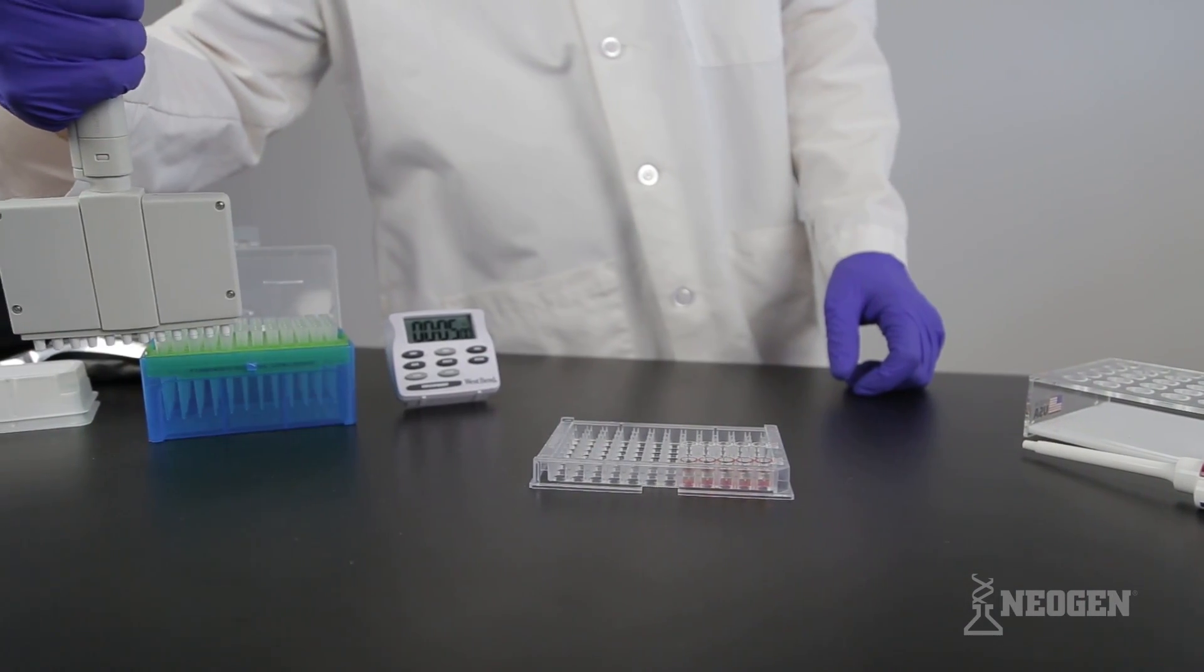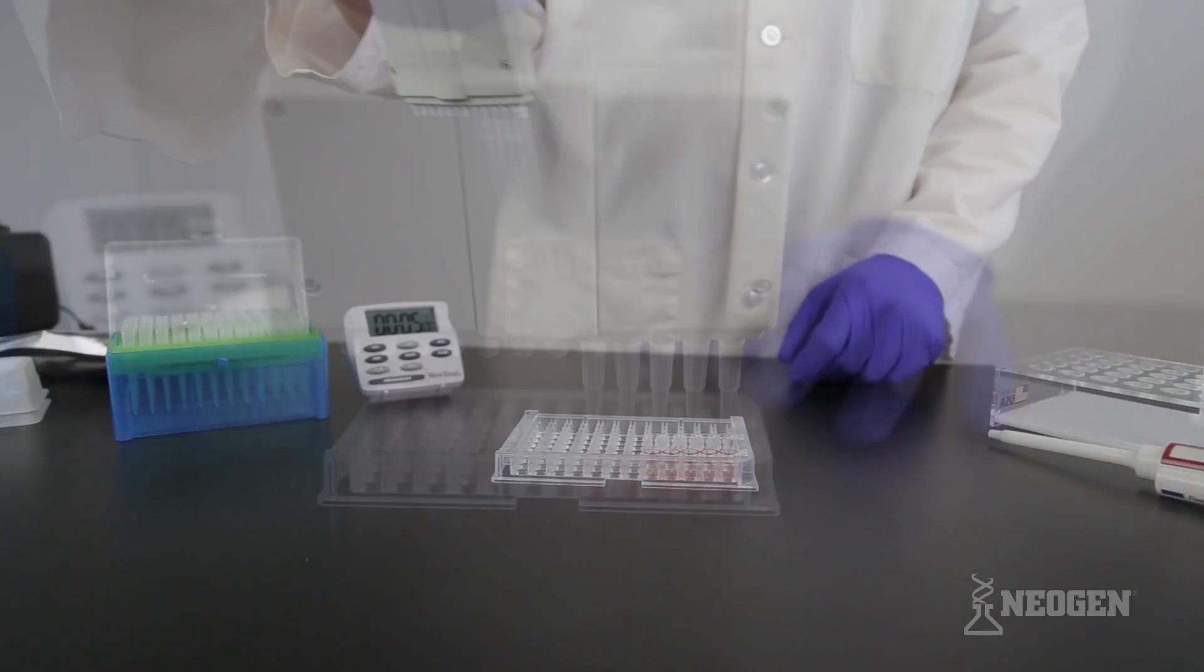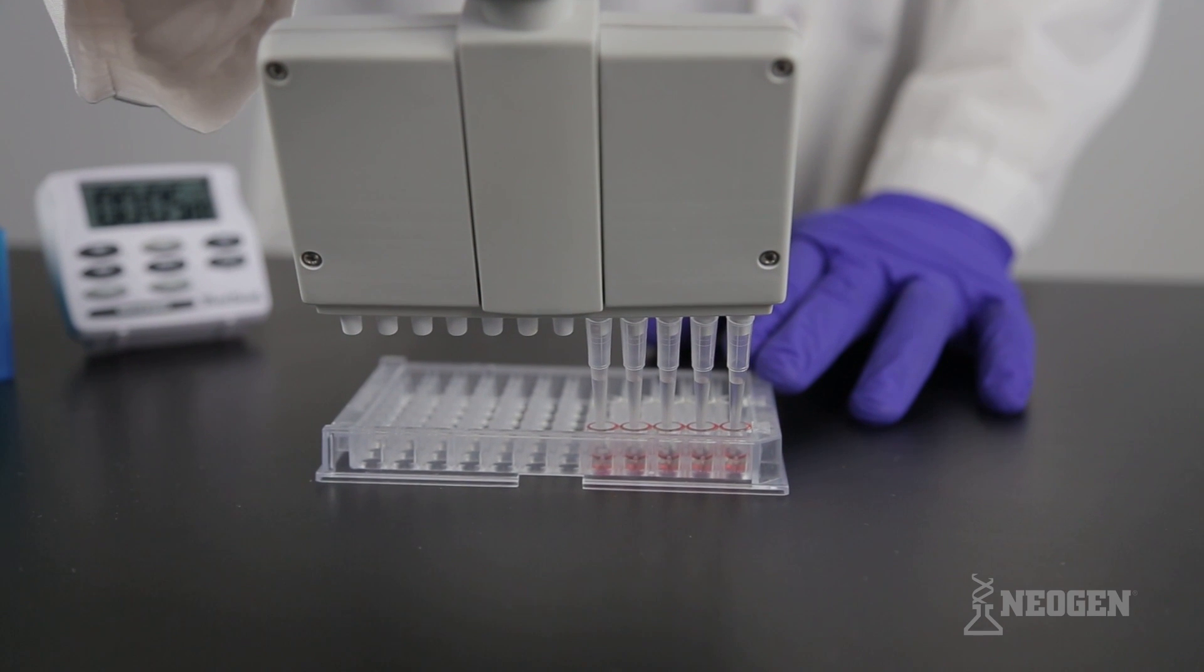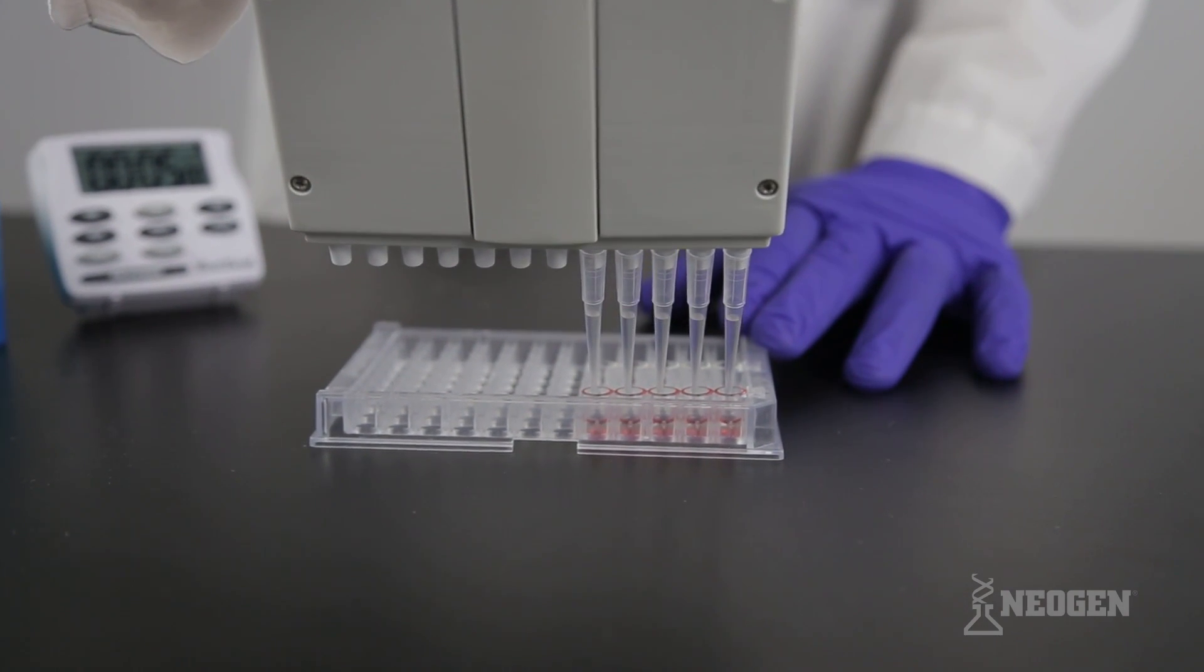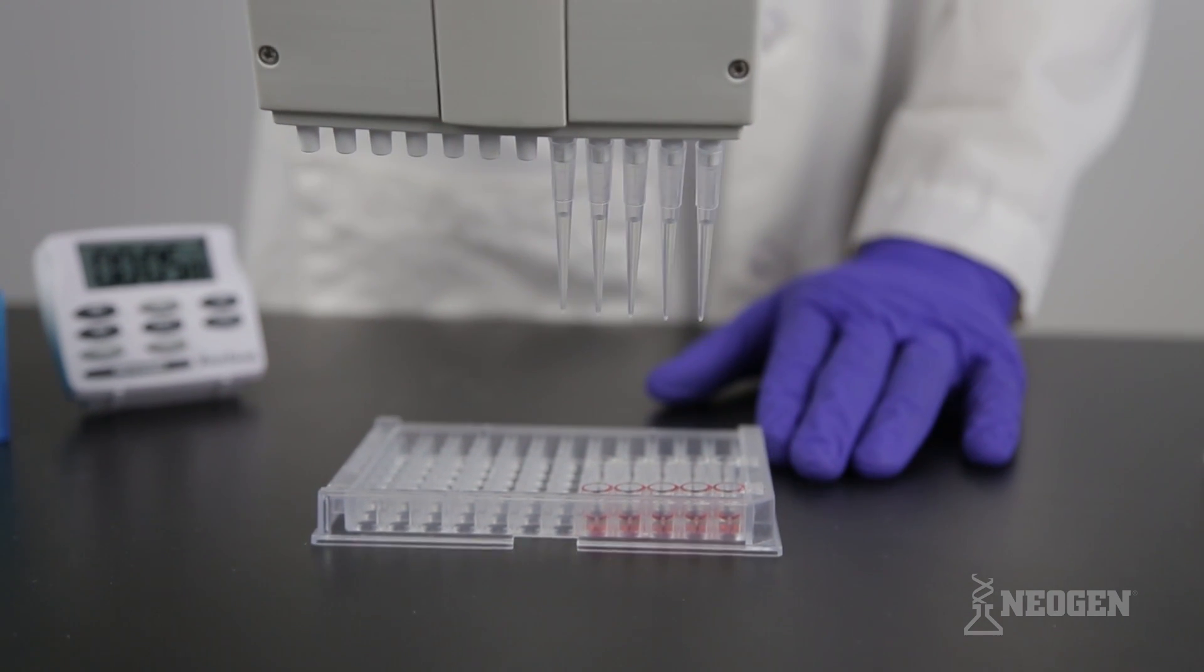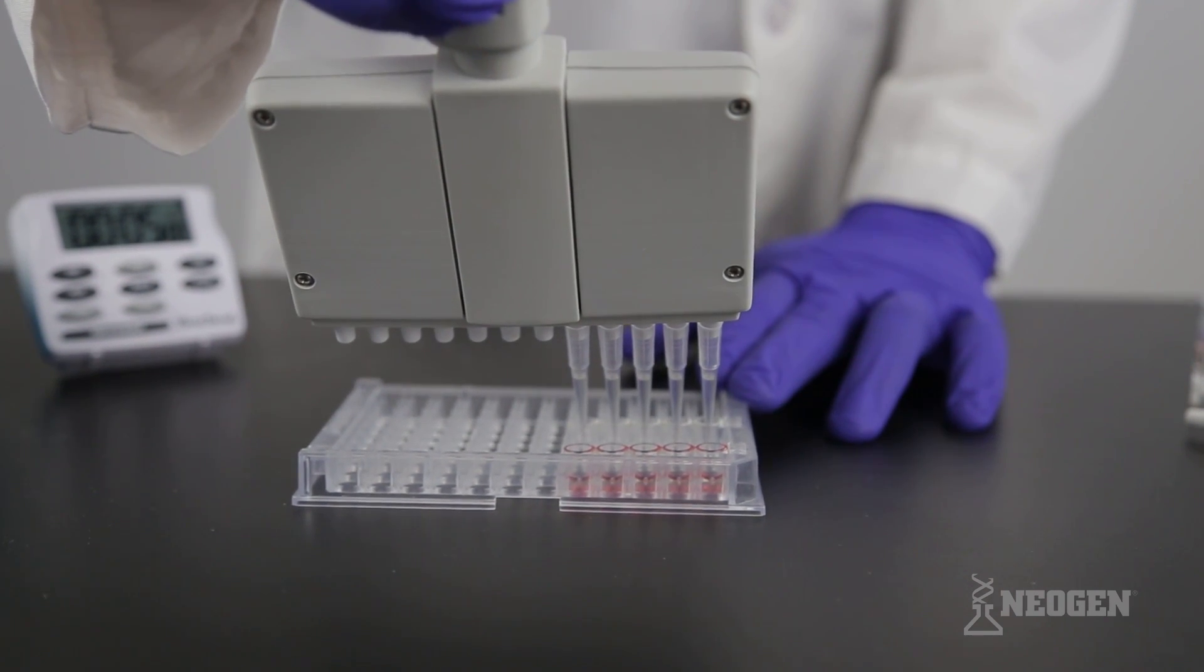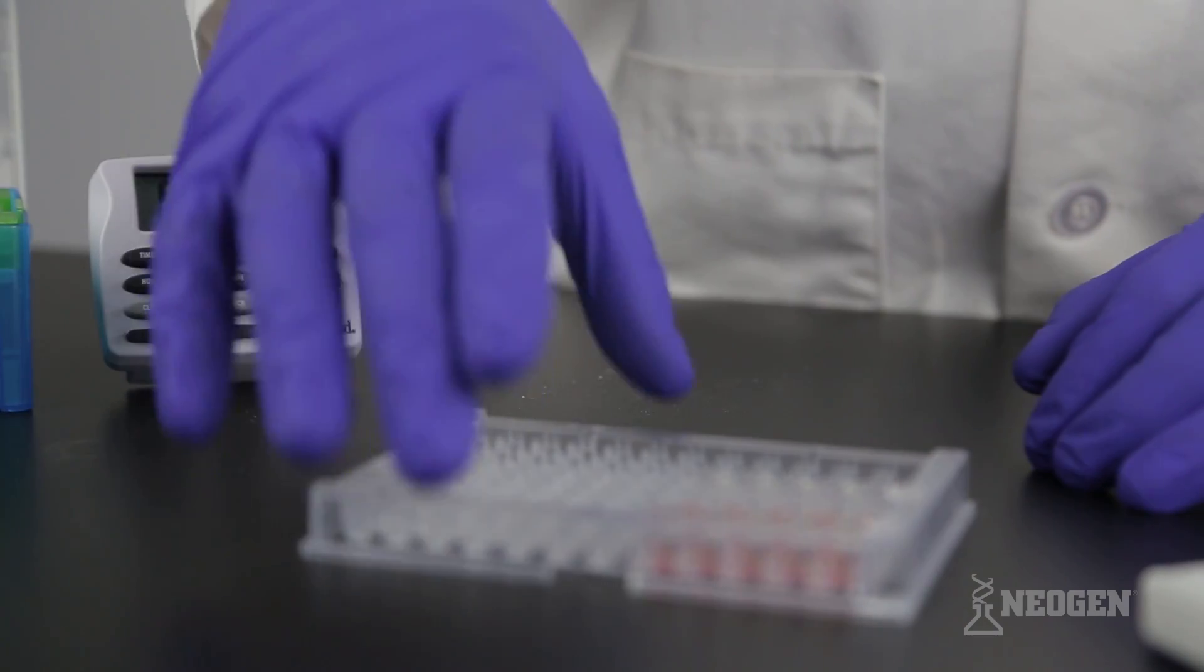Using a 12 channel pipetter adjusted to 100 microliters, place the appropriate number of pipette tips onto the pipette. Mix conjugate and samples in the red marked wells by pipetting up and down five times. Draw up 100 microliters, making sure no bubbles are present in any of the tips. Transfer 100 microliters of sample into the clear antibody wells.